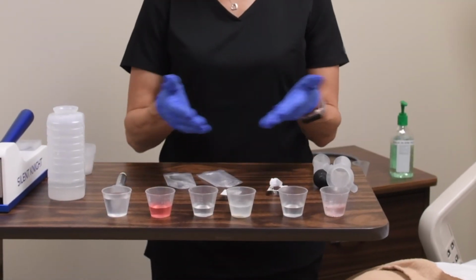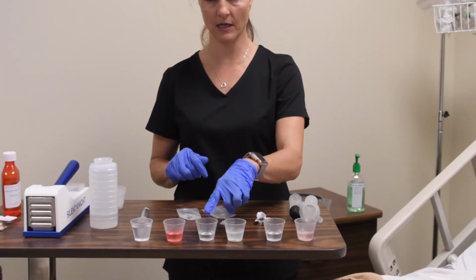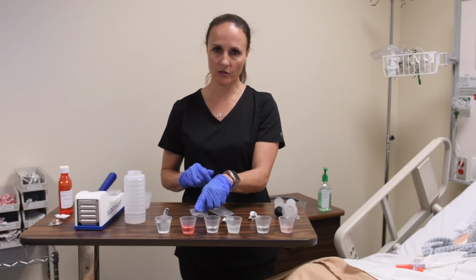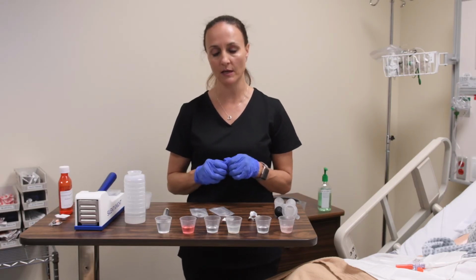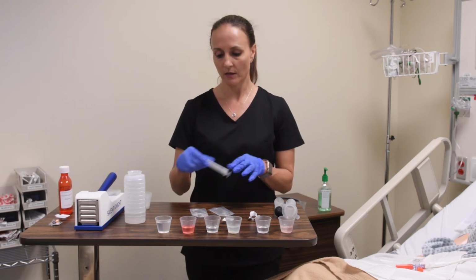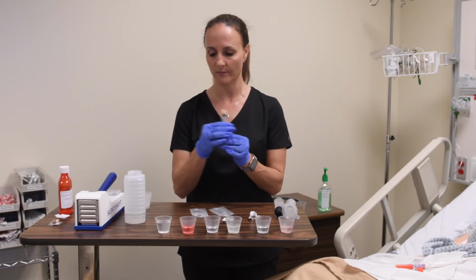I have all my medications ready. I have a medication, 10 mLs to flush, medication, 10 mLs, medication, and then 30 mLs at the end. One thing I want to make sure to mention to you is if you have liquid medication, sometimes you may not be able to get the exact amount in this cup. For example, say you only needed 6 mLs. You can always use a syringe as well and draw up the exact amount until you get to 6.